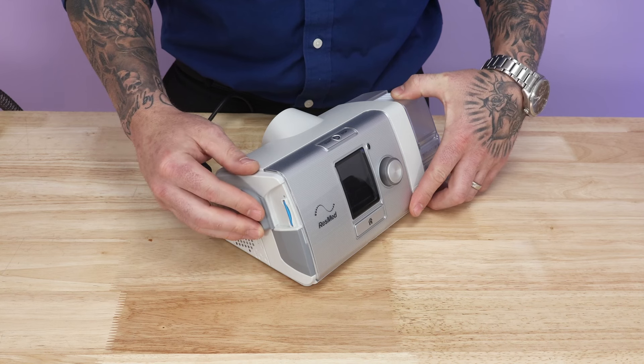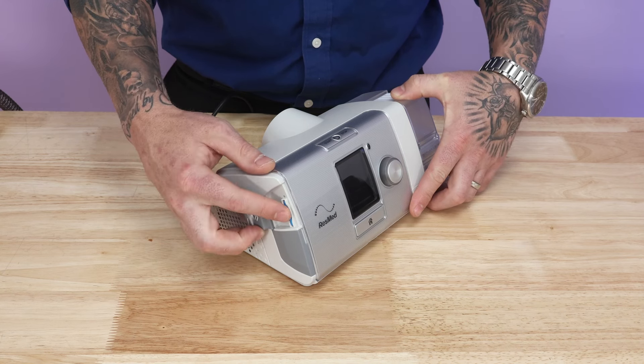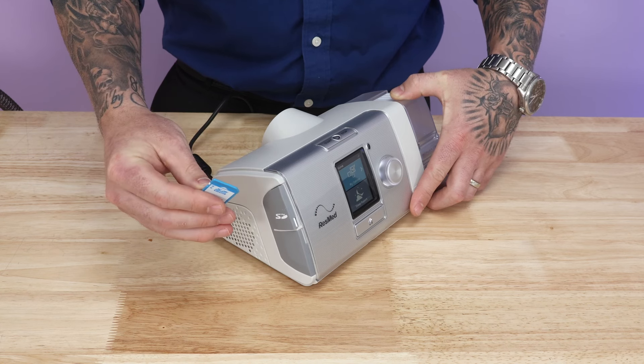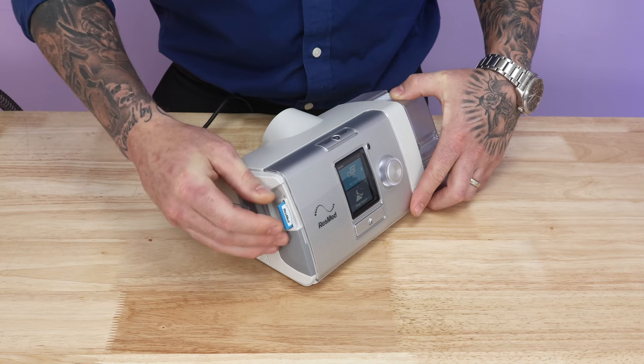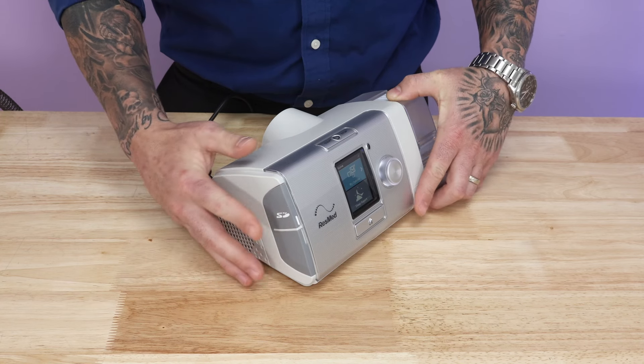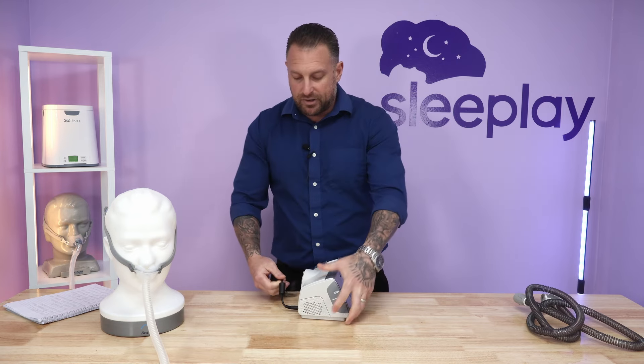This is where the SD card is located — it's just memory storage for the machine. If you need to bring this to the doctor for a reading, pop it out, they'll slide it into their SD card reader, and you're good to go. You can slide it back in and it will continue to store the memory on your machine.